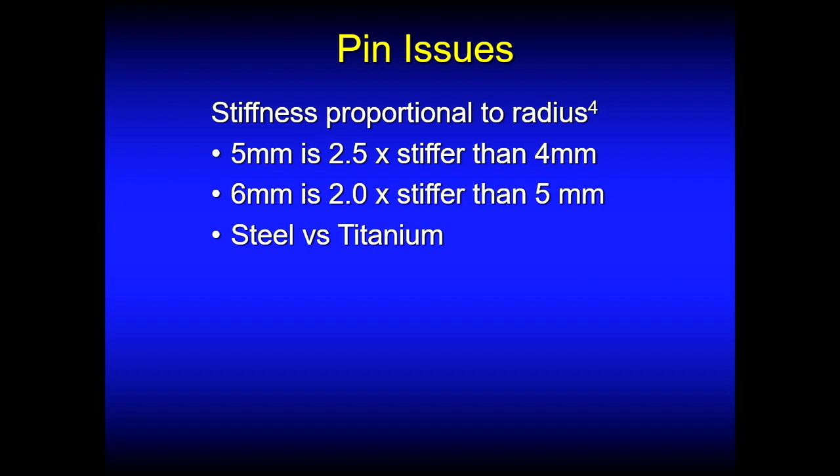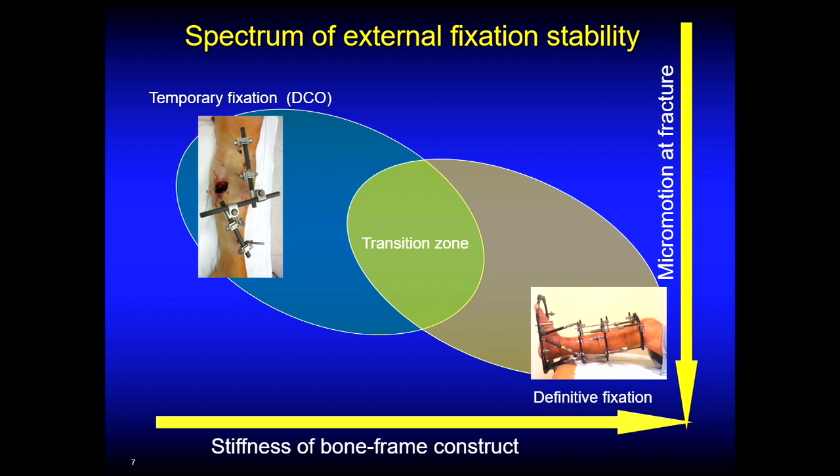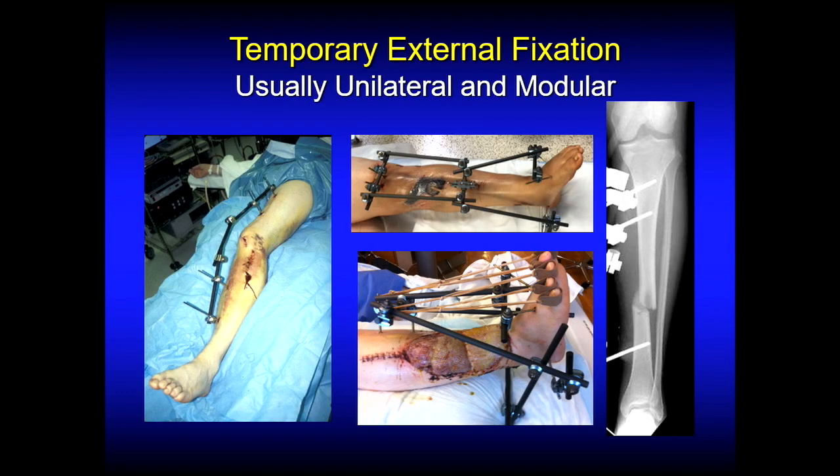And then there's steel versus titanium. How do you put the pins in? Do you pre-drill? What pin design? Is HA coating important? We'll talk about all those issues. So this slide is probably the most important thing. There's a spectrum. External fixation occurs across the spectrum from temporary, in which there's quite a bit of motion, all the way down to control of finer and finer motion to the area where you can now get bone healing, at the other end of the spectrum of external fixation.